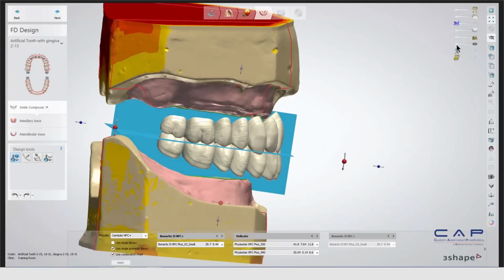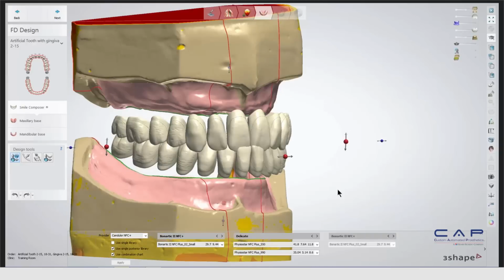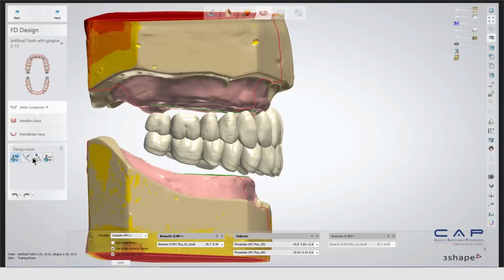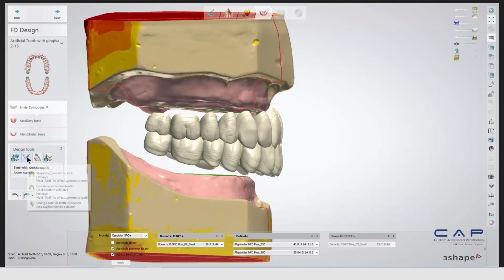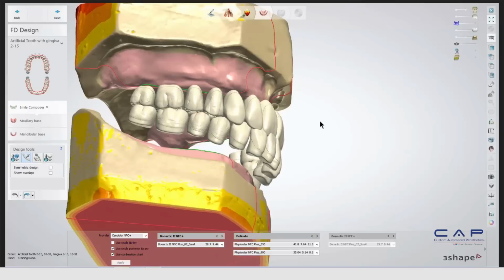So I'm going to remove this plane there and just go ahead and set up our teeth using the design tools. The first tool over here is just going to help to adjust the whole occlusal plane adjustment. So it's not going to be one arch or the other. It's going to be the whole arch together, okay? The second tool is going to be the arch setup, which allows us to customize individual points of the arch.